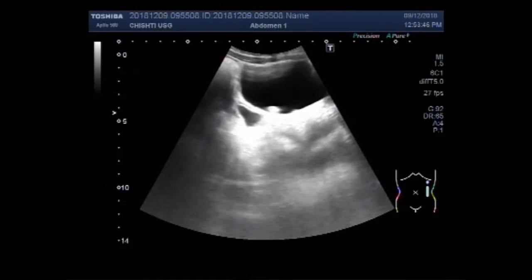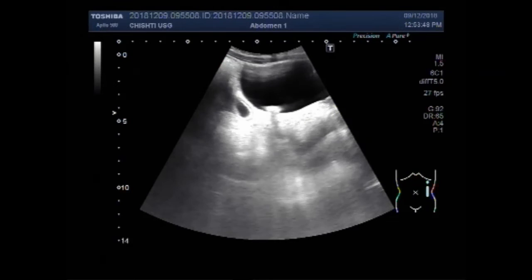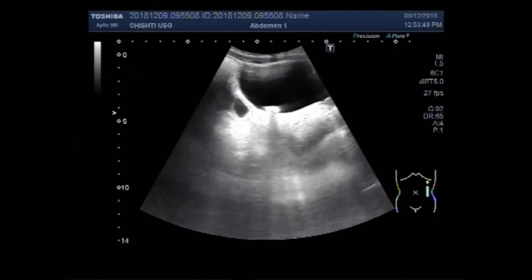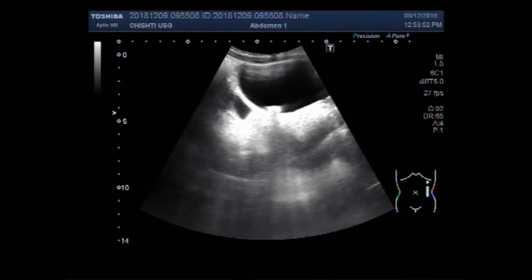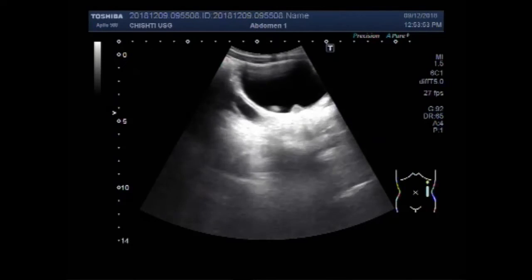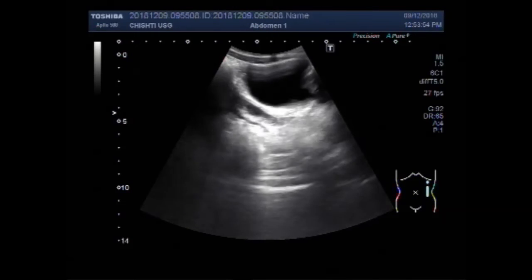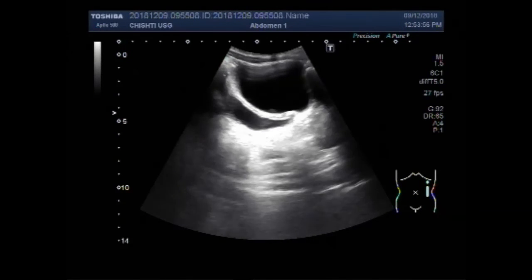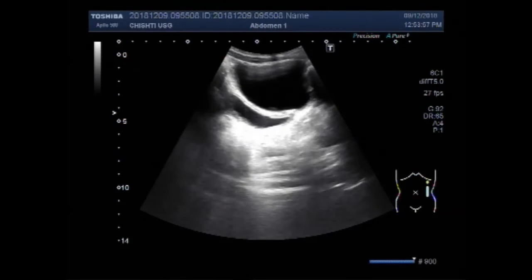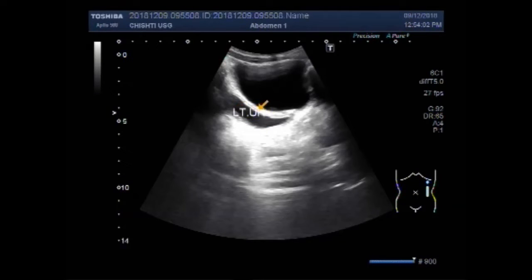There is also a vesical calculus. This one is the dilated left ureter.